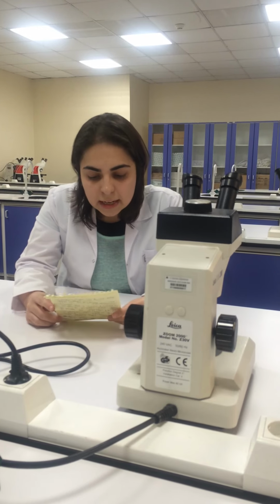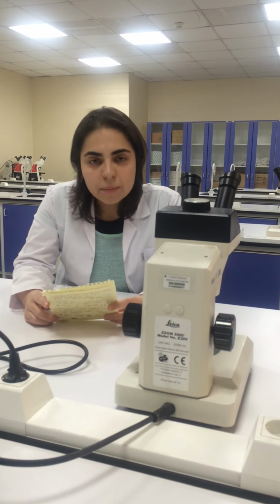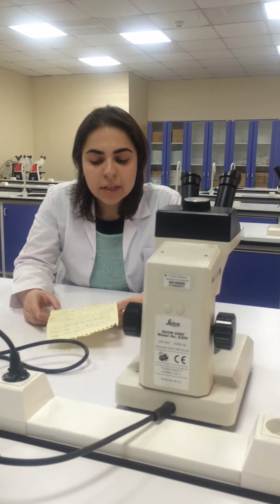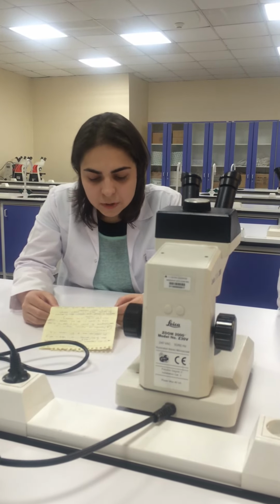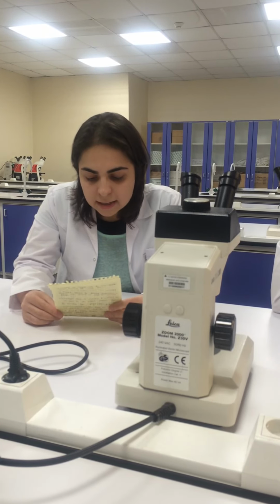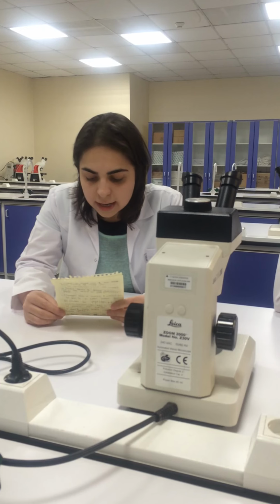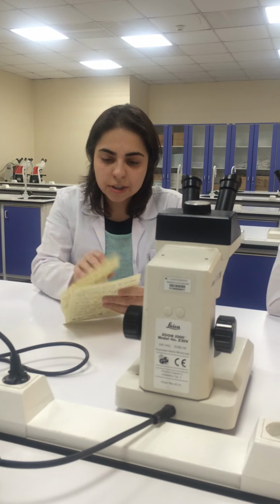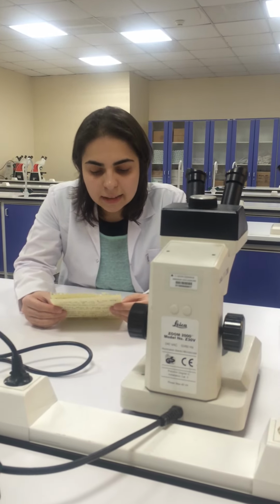Second step is dissection of adipose tissue from pigs. All plastic and glass instruments are sterilized and medium is placed at room temperature. Piglets are sacrificed by an appropriate method such as electrical stunning or exsanguination in accordance with a regulation. Dissection is done carefully and immediately.